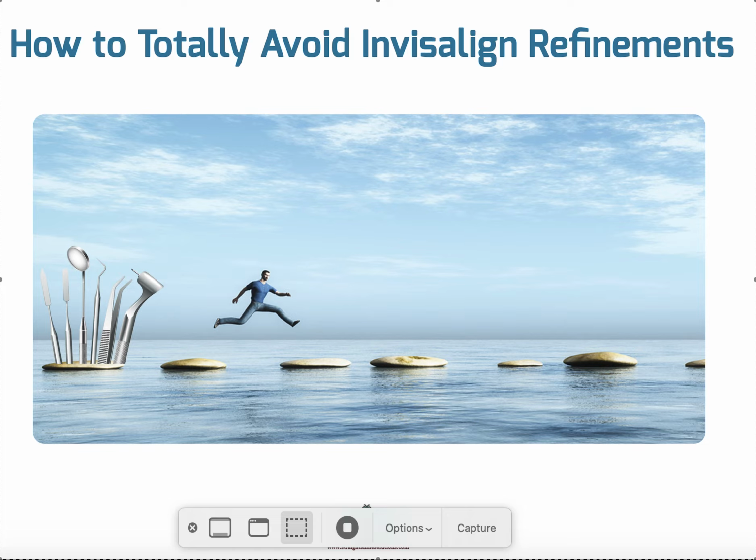Now, of course, the aligner companies don't like anything that I'm saying, even though you'd think that they would, because it's actually making more success and it's making fewer revisions, refinements, mid-course corrections, which saves them money, and the patients are going to be happy and the doctors are going to be happier. So I consider all this a win, but it's also going to cost them more off the bat, because we're taking a plan where the average doctor has said okay to 20 and I'm saying make it a 40, which is going to cost more overhead for them, right? Because it's unlimited. But actually, my doctors that do this, they have way fewer revisions, refinements.